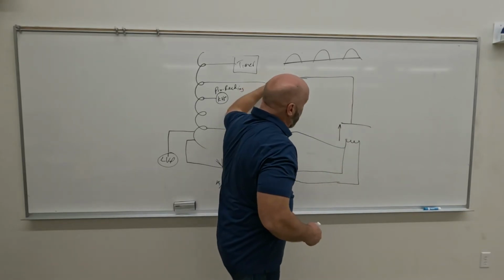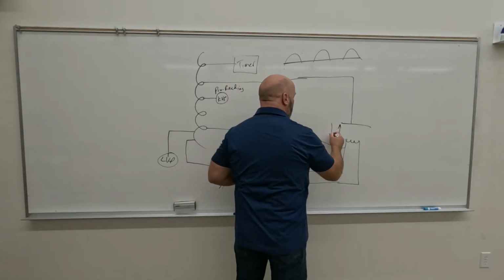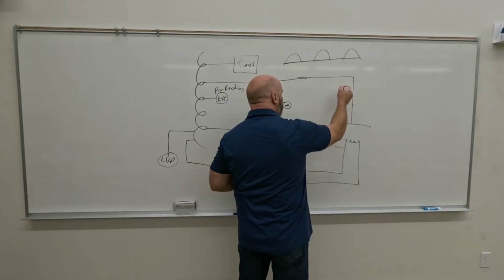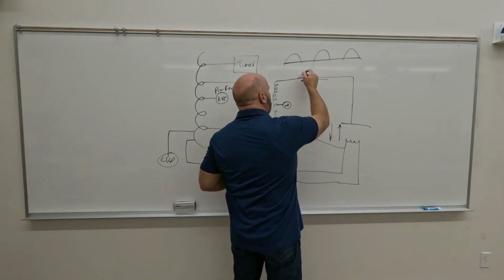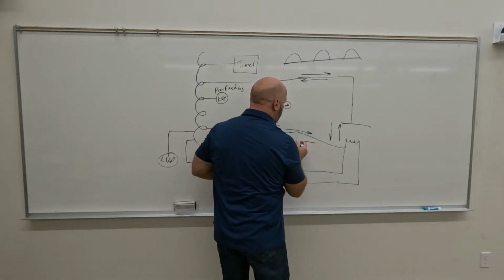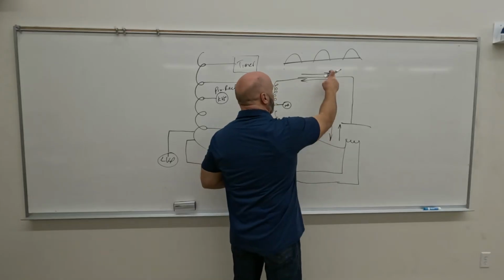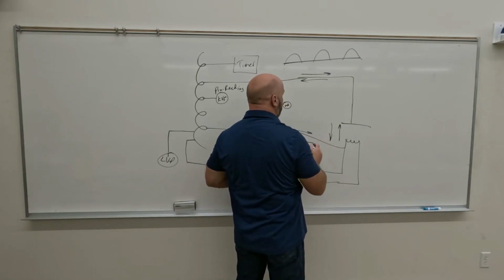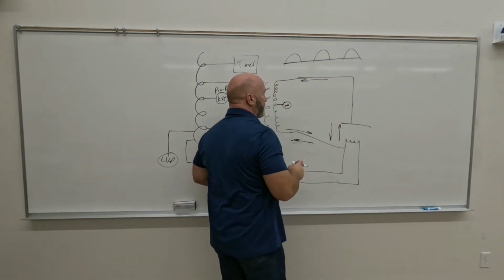If we have it going in both directions, then electrons go all the way through the tube and out the other side, and then they reverse and go back that way. So we want to eliminate this, and it doesn't really matter if that is eliminated or not, but we definitely want to eliminate that.